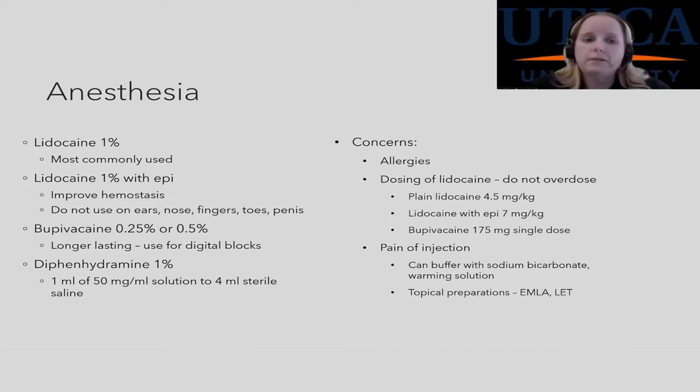You take 1 ml of the 50 milligram per ml solution with 4 mLs of sterile saline, you mix it together and you inject it. And you can use that as anesthesia for people that are allergic to caine products. So you can use that. And lidocaine also comes in different strengths as well. You can use 2% as well.